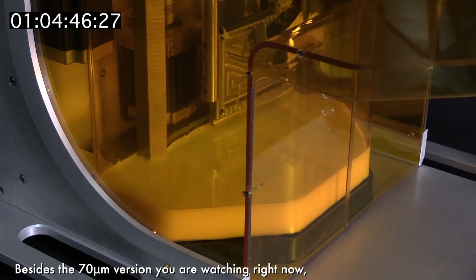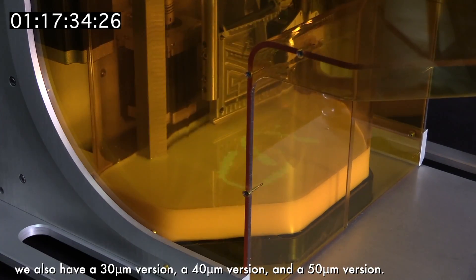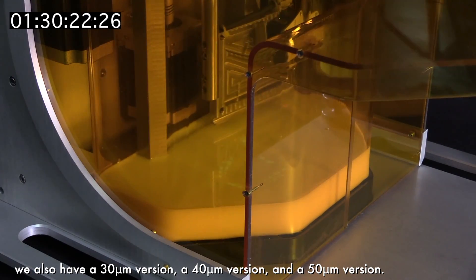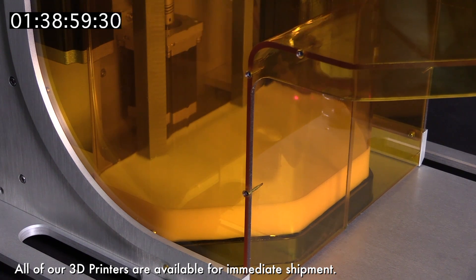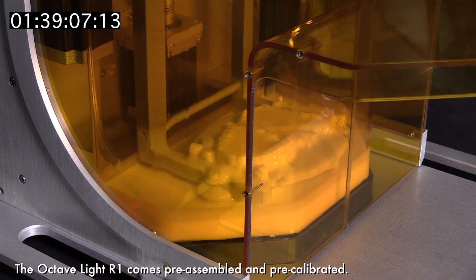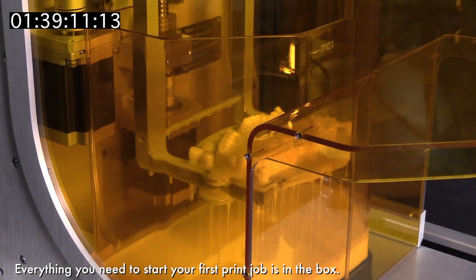Besides the 70 micrometer version you are watching right now, we also have a 30 micrometer version, a 40 micrometer version, and a 50 micrometer version. All of our 3D printers are available for immediate shipment. The Octave Lights R1 comes pre-assembled and pre-calibrated. Everything you need to start your first print job is in the box.